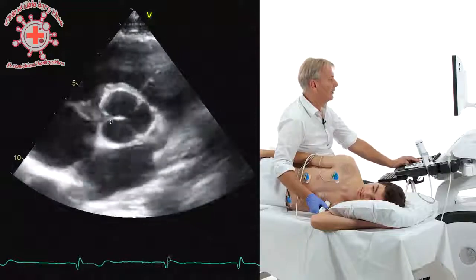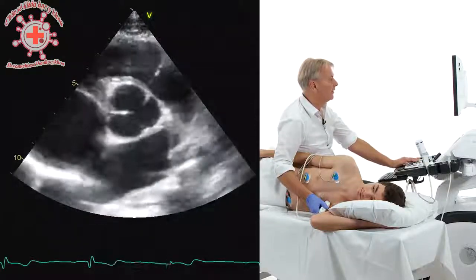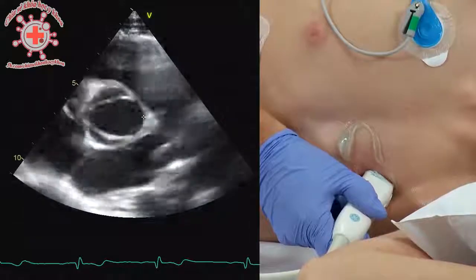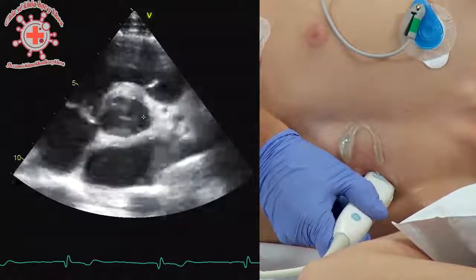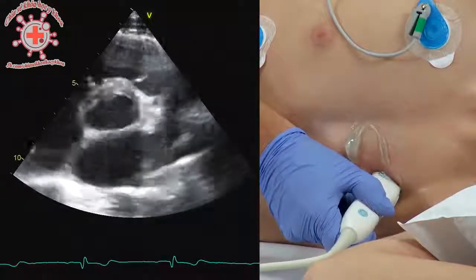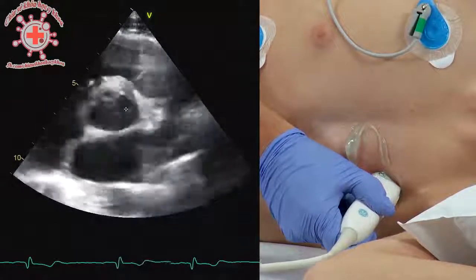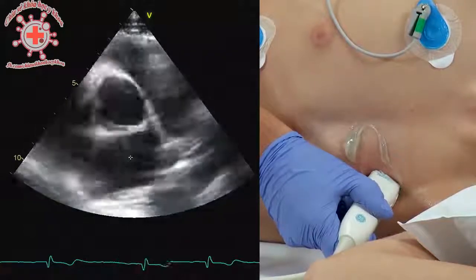This is the right coronary, the acoronary, and the left coronary cusp. Coming off of the right coronary cusp, you have the right coronary artery right here. Sometimes it's even possible to see the ostium of the left coronary artery. In our individual here, since he's an ideal model, you can actually see it right here. Sometimes you can even see the bifurcation between the circumflex and the LAD.